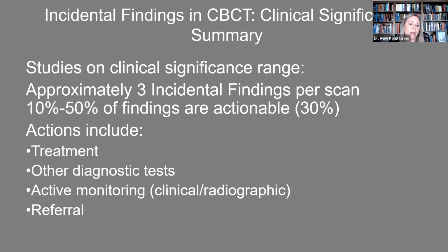And I want to talk a little bit about referrals, because of the world that we live in in radiology, we do tend to send things in the sinuses, any of the paranasal sinuses, that sort of thing, we tend to think of ENT. And so you'll notice that I'll say ENT. Sometimes people ask, well, what about oral surgery? And certainly, if we find stuff within the maxilla or the mandible, absolutely that is going to oral surgery. When we get into our sinuses and our airway space, I understand there's a little bit more of a turf war between some of our oral surgeons and ENT.